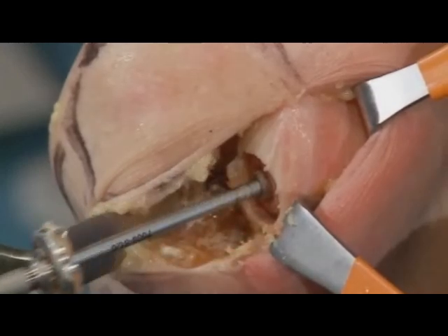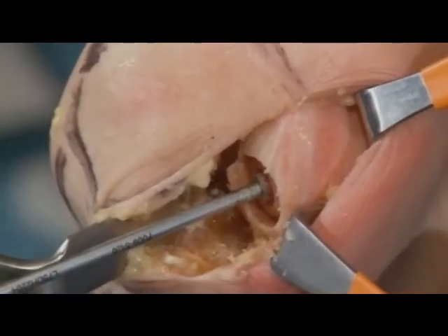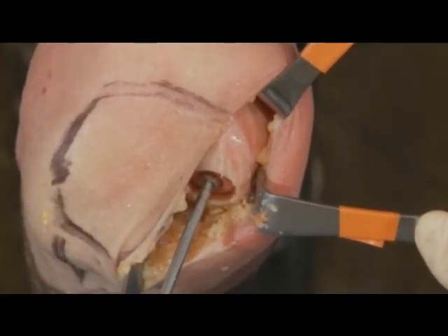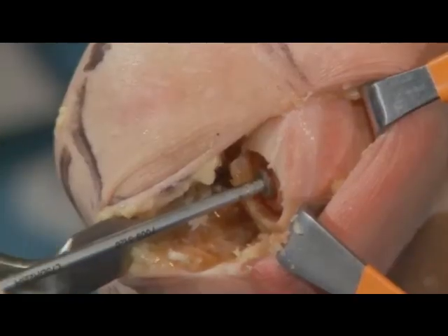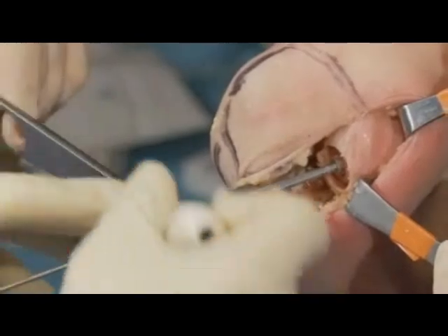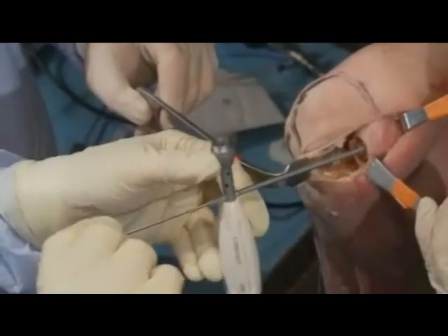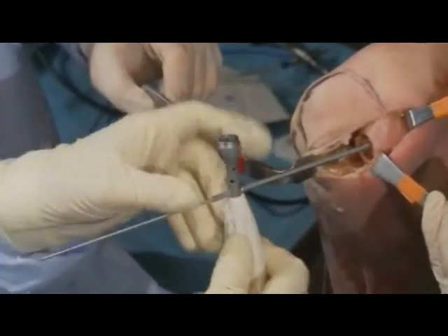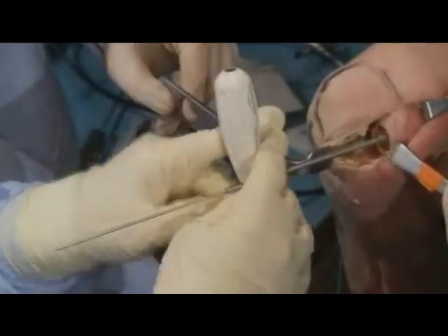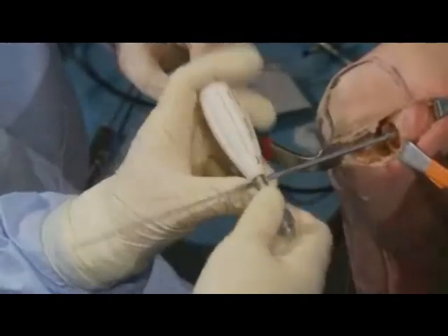So once we're happy there, we take it out, and you can see the central hole is reamed. I don't know if you can get a nice picture on that. And then we remove the centering shaft that we had in there from before. This comes out. I use the handle so we don't screw up the pins, we don't get off axis. We know where we are with everything, because I want to leave this pin in and take this centering shaft off, because now we have to ream top and bottom to get the curvatures of the implant in the top and in the bottom situation. So we take this out.